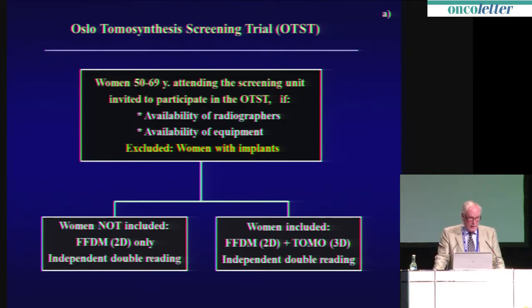And if the women were heavily disabled and couldn't stand, we examined these women in our clinic and not in the screening units. But basically, all women were invited to participate if there was availability of the radiographers and availability of equipment.